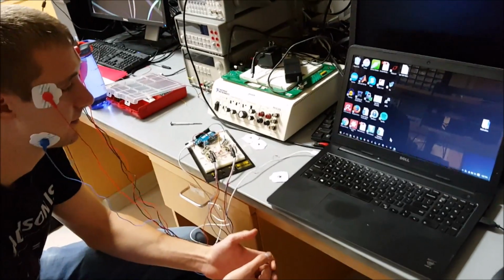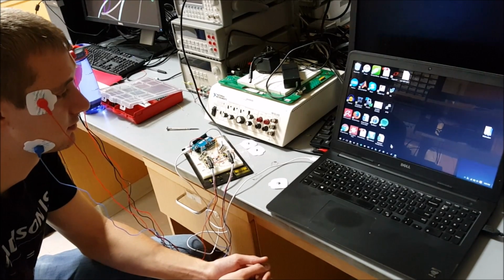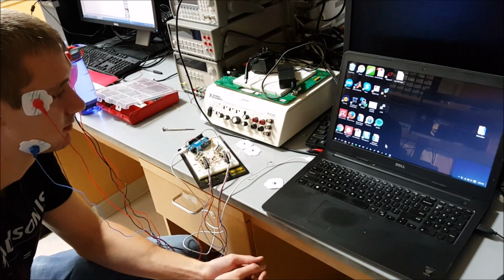So here we have a live demo of our EOG mouse. Now Clint will try to open the folder on his desktop using his eyes.